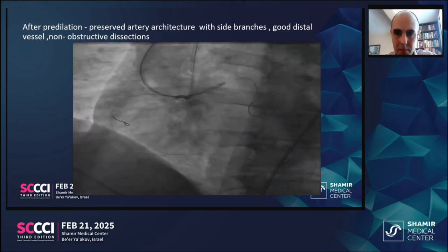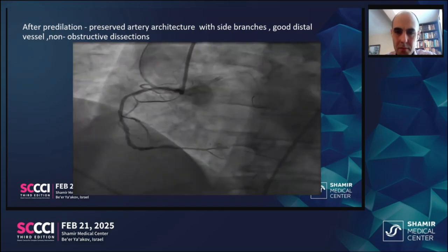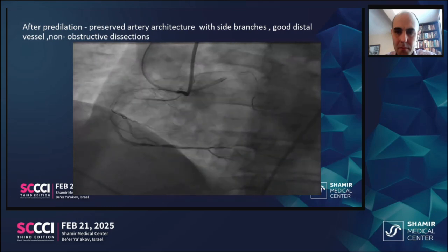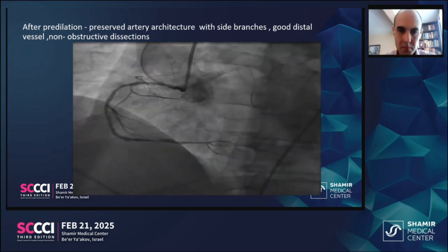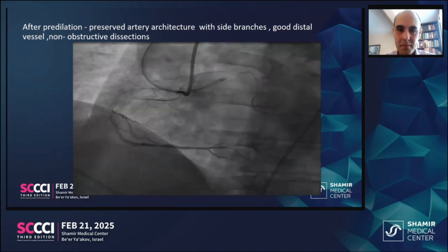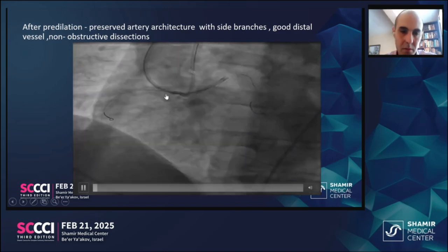Just a case of argument, the distal artery, the distal bed usually grows after you restore the blood flow, even in a very surprising manner. You can do a follow-up angio and see how large actually these branches are. So this is the situation. We support imaging and probably stenting all the artery. Thank you for all the comments. They were absolutely correct and well said.